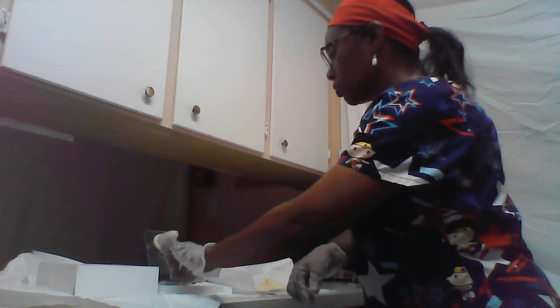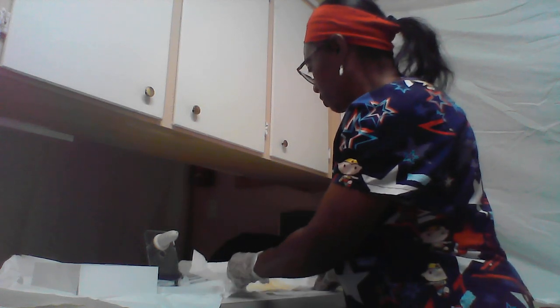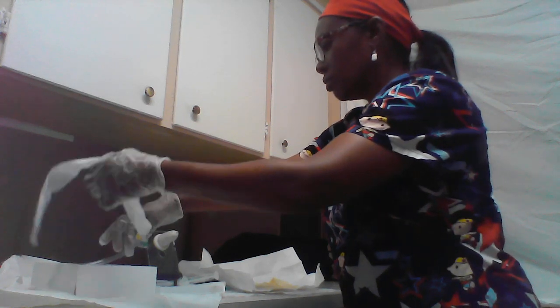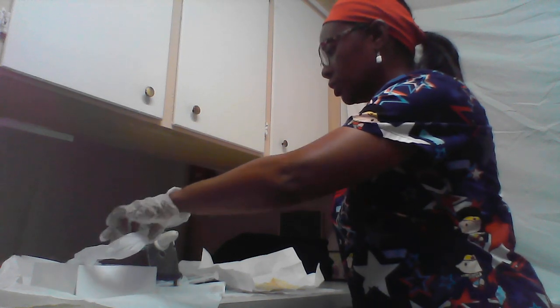I have my alcohol swab. I have my syringe to connect to the Foley catheter. And I'm going to get out the catheter. And you already have a protective lining on it.